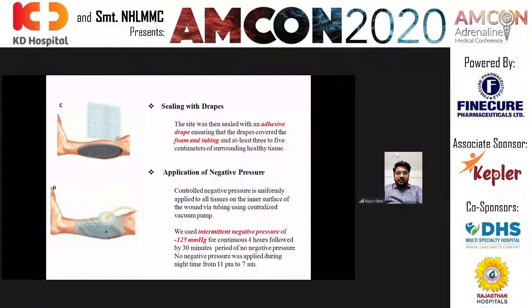Next, with the help of plastic drape adhesive material, it was made completely airtight, covering around 3 to 5 centimeters of the normal margins of the skin. A drain was connected to it, and it was connected to the suction device. In this study, we used intermittent negative pressure of around -125 mmHg. We used 4 hours of active pressure and 30 minutes of pressure free. At night, we did not switch on the negative suction pressure for the comfort of the patient. Next.